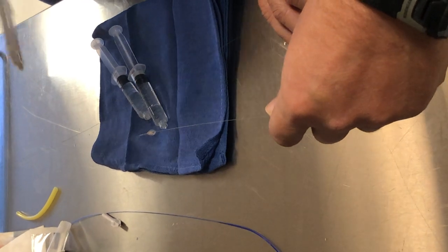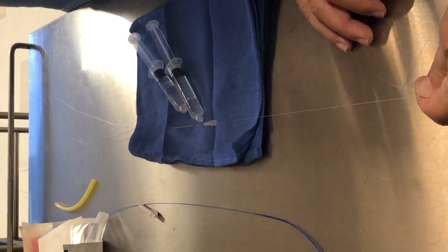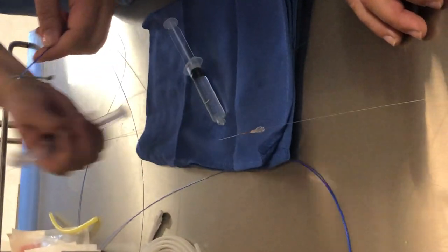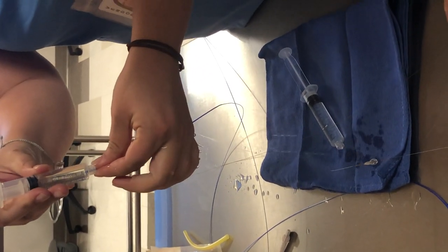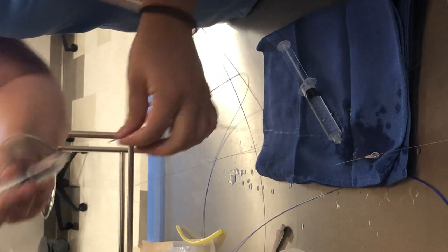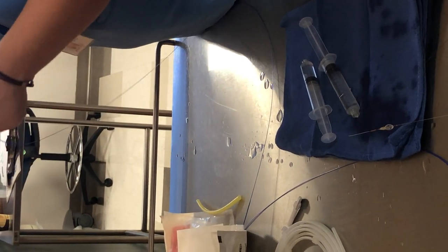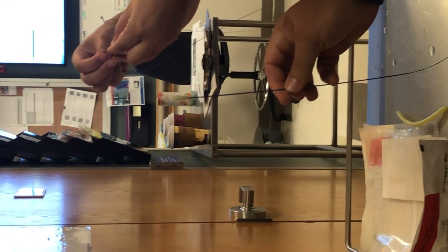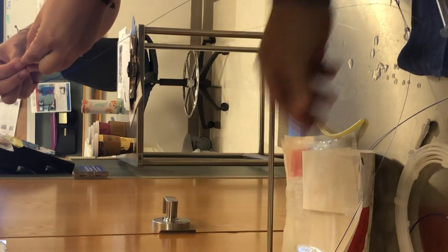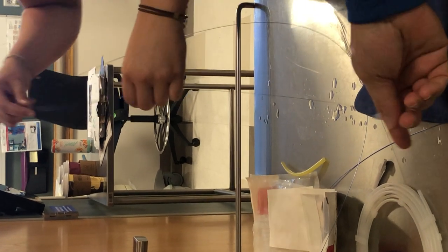Let's say we've done our carotid stenting and we're ready to take this out — and we did not throw this away. Give it a little back flush. You can tell which one is your retrieval sheath because it has this plastic piece on it, in case anyone gets confused. This gets loaded on another monorail system.